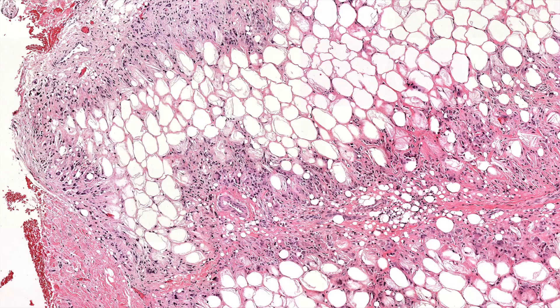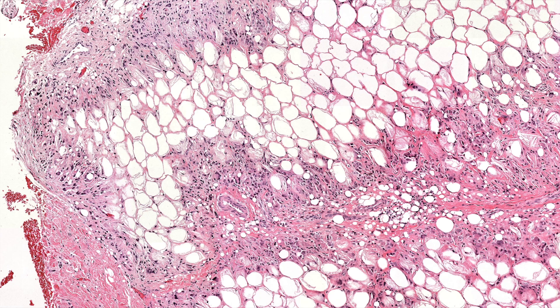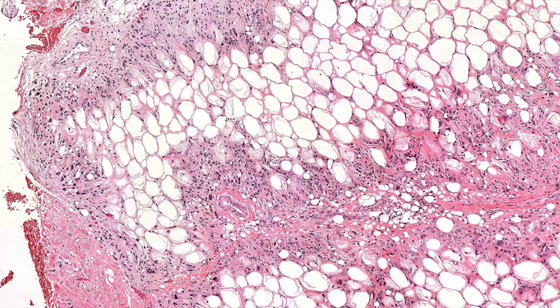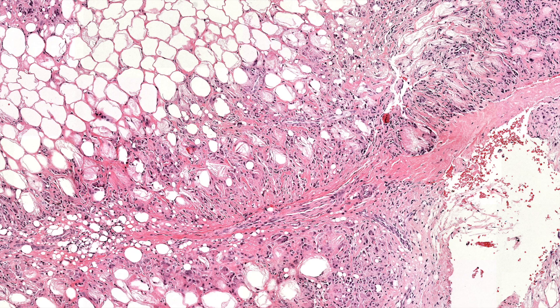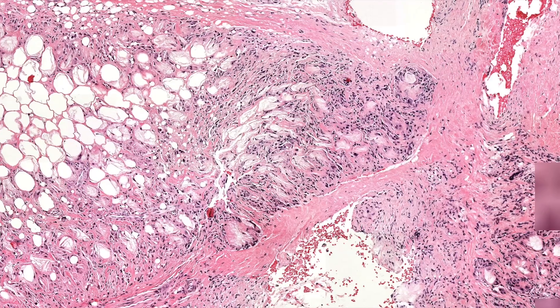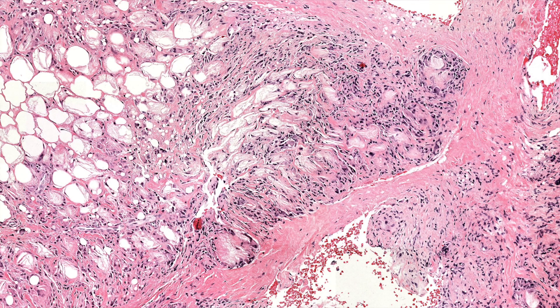This pattern happens interestingly in young babies only — I don't think I've ever seen it in older kids or adults. The thought is that it's because of the different fatty acid content in baby fat versus older people's fat. I have seen this pattern in a baby in a different situation.